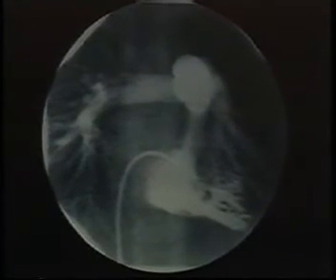Now, other tumors other than a myxoma that occur in the heart can be of any cell type, as tumors arising from connective tissue or striated muscle. This was a young child who had some limitation of his activity, was admitted for study. This is a right ventricular angiocardiogram with marked narrowing of the infundibulum. This is right ventricle, pulmonary artery, and there's marked narrowing of the infundibulum. You can see this mass of soft tissue encroaching on the infundibulum in the lateral view. And the diagnosis was made of infundibular stenosis. The child was scheduled for an infundibulectomy.